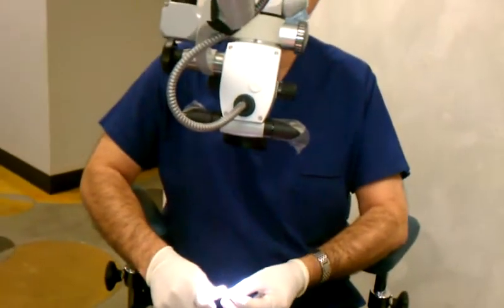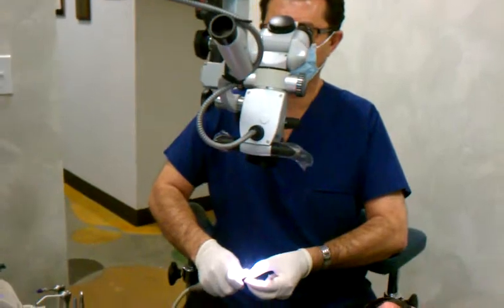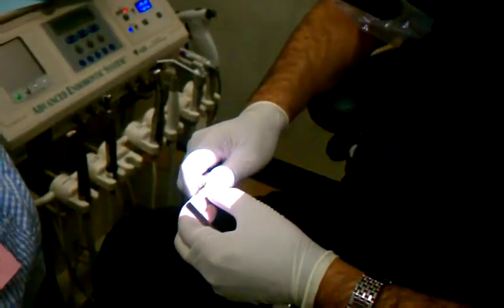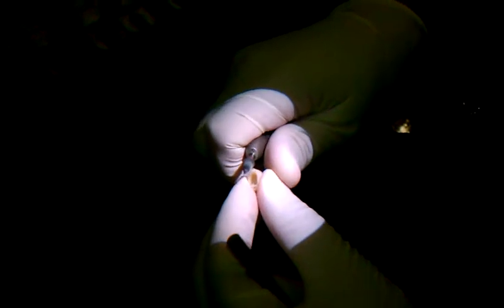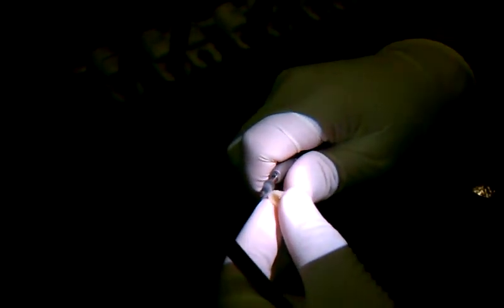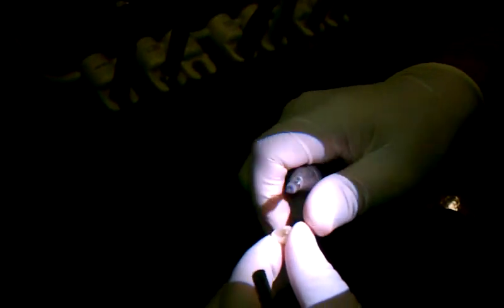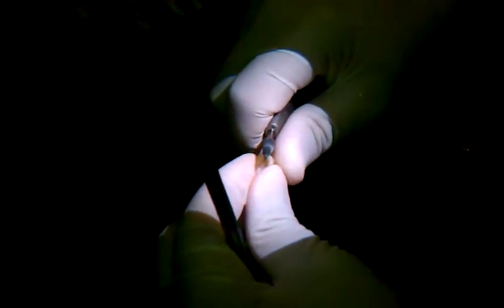Make sure I read the margin correctly. Of course, if you don't have a scope, you can use your loops. If you don't have your loops, you can do this with a naked eye. And again, it's just a temporary, so it should be okay. Remember, this was an impression taken when the patient came in. The occlusion — there should be no occlusal adjustment needed, because it's going to fit perfectly. It's just a duplication of what the patient had as part of the occlusal anatomy. We just refined the prep and that's been duplicated.